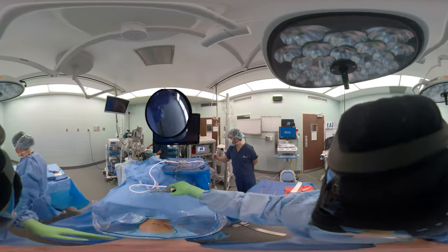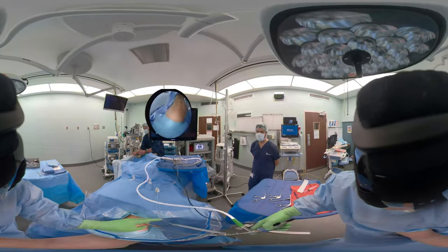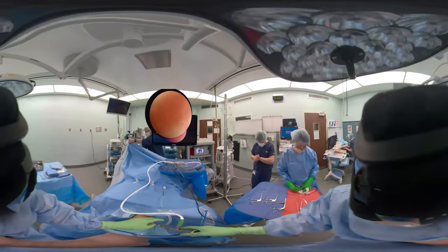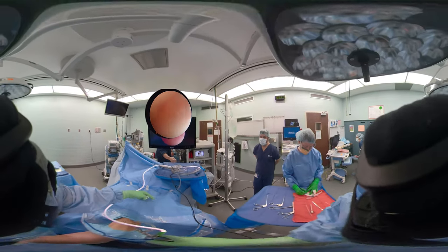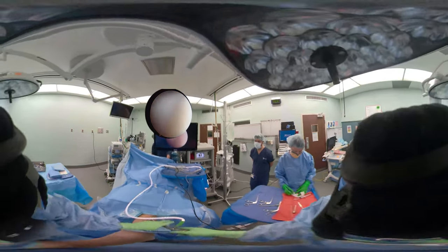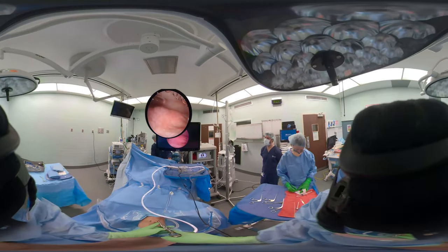Now we'll get the 30-degree arthroscope. You can see the light source — the light goes 30 degrees opposite of where the light cord is. Turn the water on. Water has to be on at the base of the camera as well as at the fluid inflow.